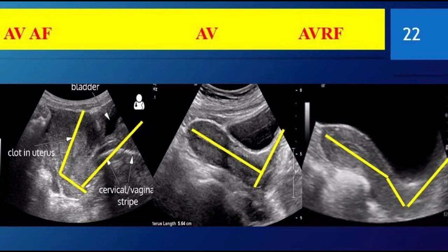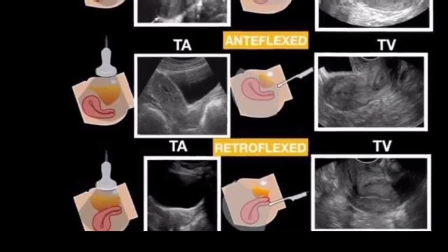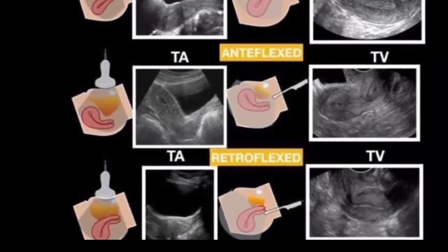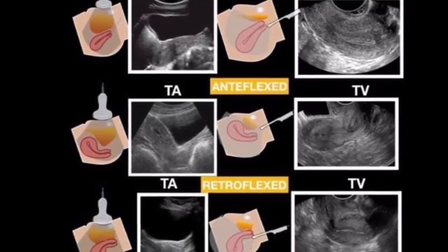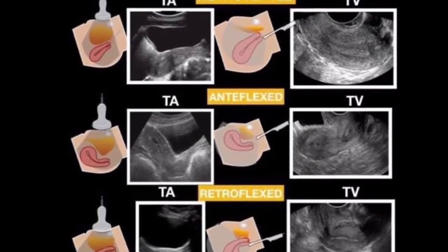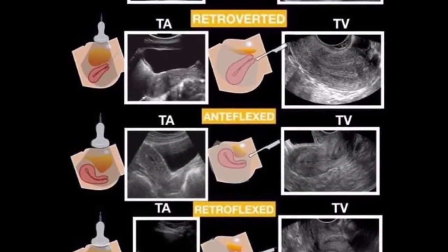The vagina, uterus, and the urinary bladder are used as reference points for identification of the remaining normal and abnormal pelvic structures. The uterine size, shape, and orientation should be identified and documented in sagittal and transverse axial planes.